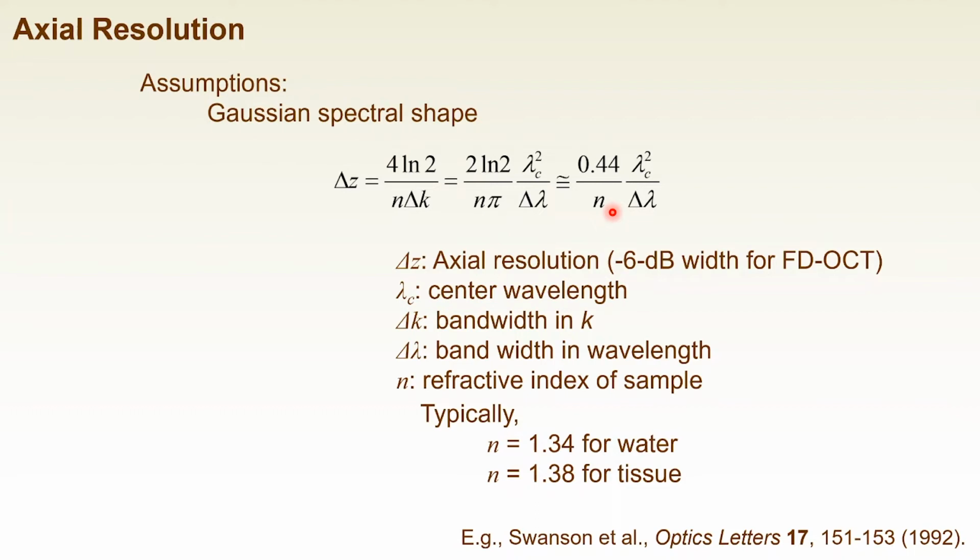Okay, in a factor of 1.38. And if it's in the water, it's 1.34. Okay, and then the second point is this one. Maybe this is the most well-known point.